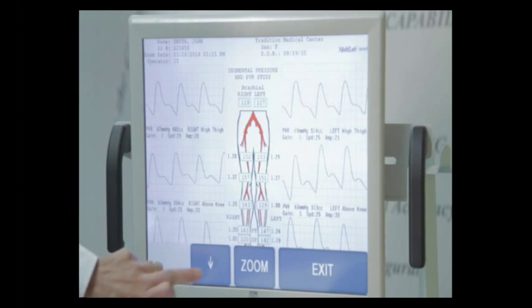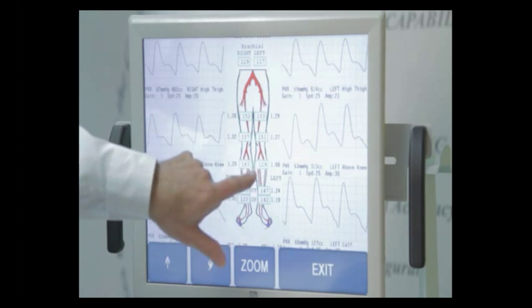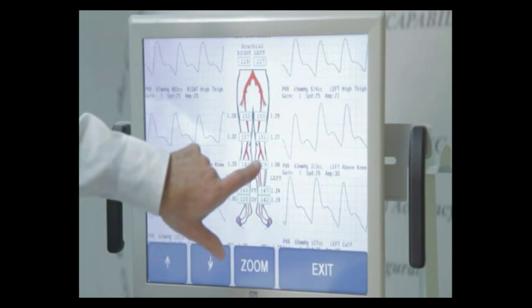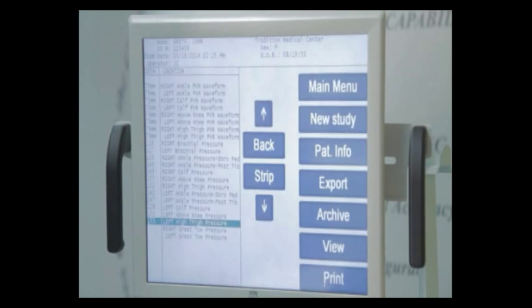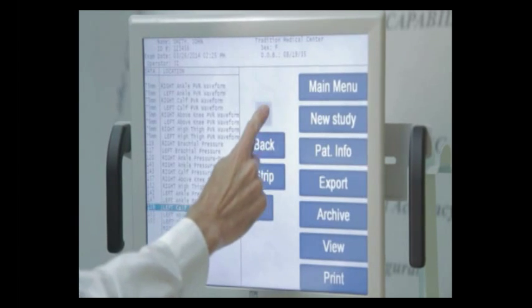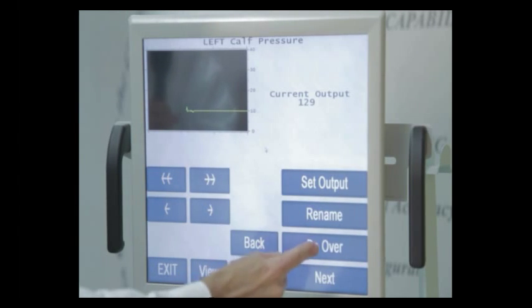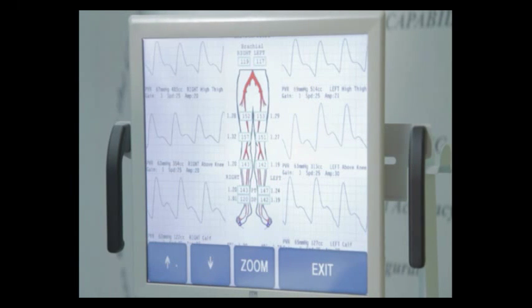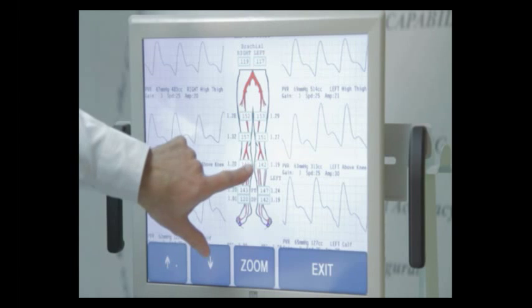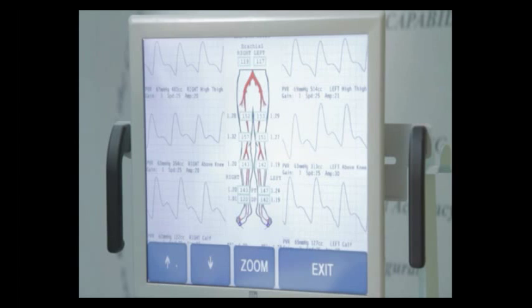My pressures, however, look a little odd. I've got 147 here, 129, and 151. I suspect I might have slipped off the vessel when I was doing the left calf pressure. To go back and perform that step over, simply press Exit, highlight left calf pressure, and press back. Press Do Over, and simply repeat that step. I have retaken the left calf pressure and received a value of 142. I am very happy with this study. It's complete in my eyes.